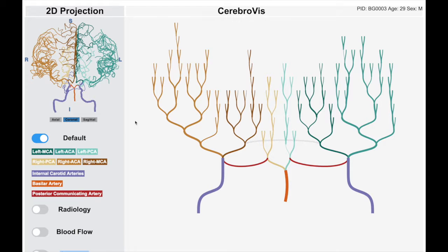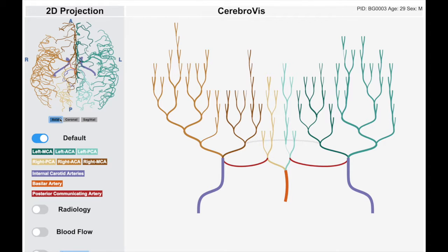For context, Cerebral Vis shows a 2D projection of the 3D isosurface brain visualization. The 2D projections can be viewed from different planes.